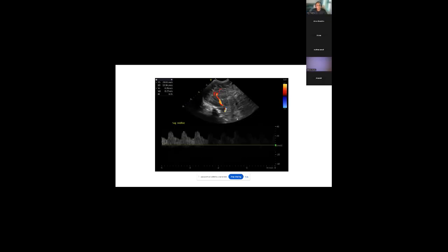So that's just that one, and then we just did the RI. Brilliant. That's perfect for the RI. Perfect alignment. It's the right place. So, yep, brilliant. And that's that. Amazing.